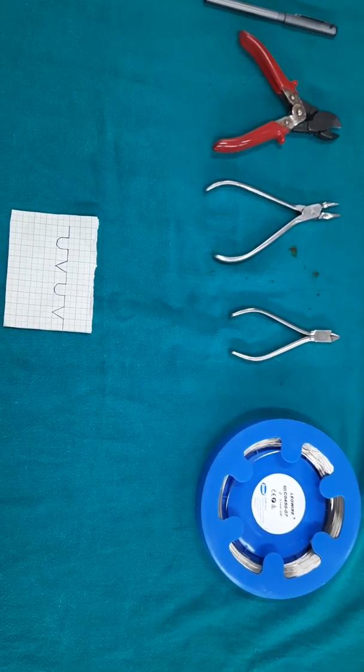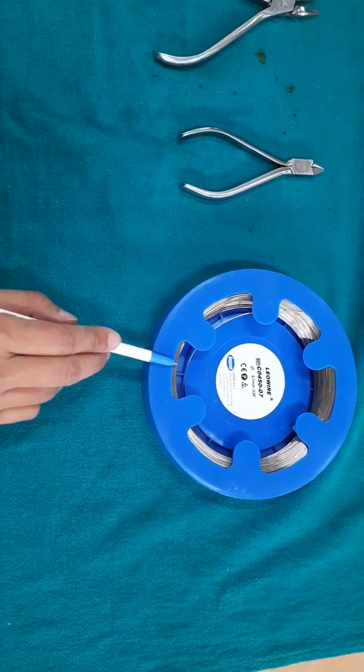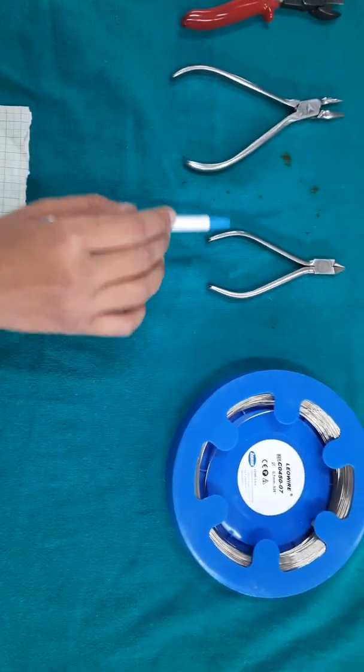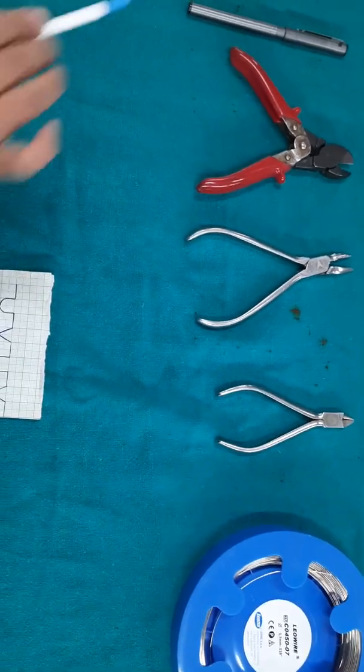The armamentarium required are orthodontic stainless steel wire 0.7 mm, add-ons plier, universal plier, a wire cutter, marker, and a graph paper.